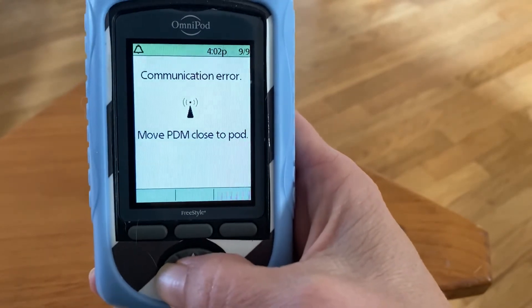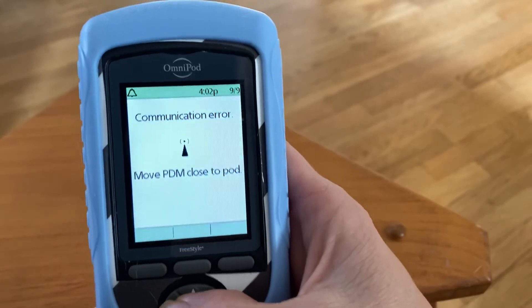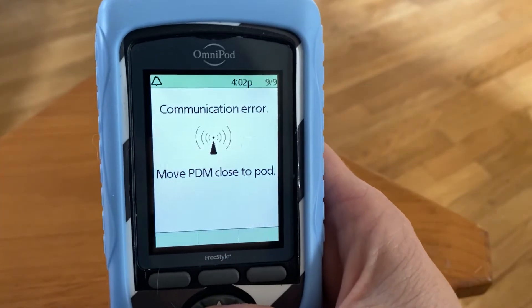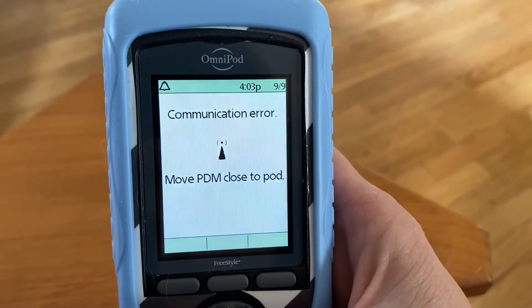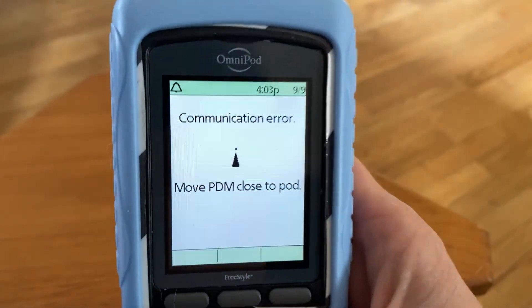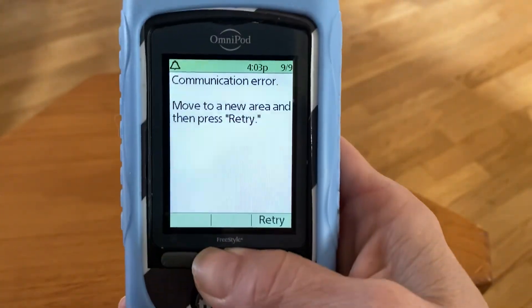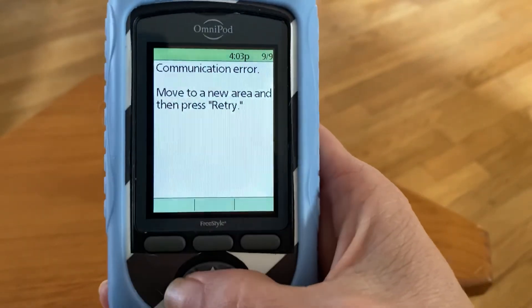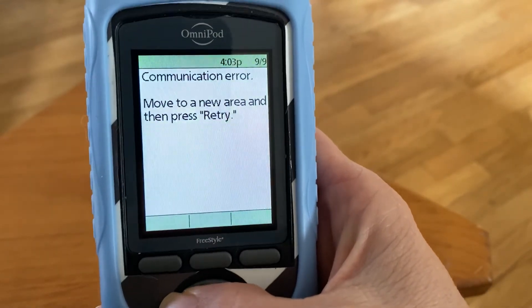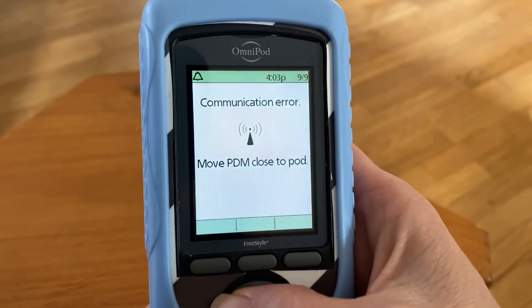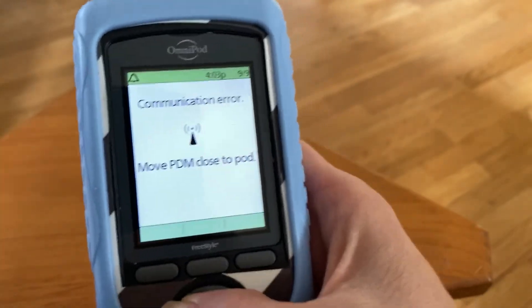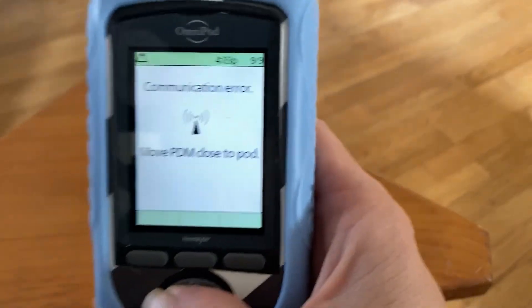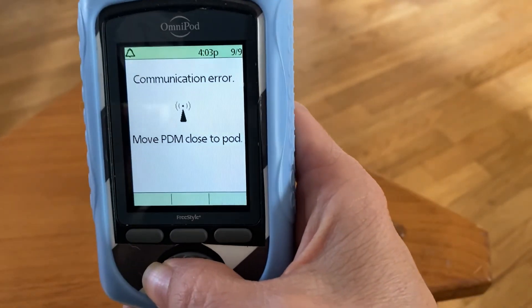The other option in there was to suspend the basal — I've never done that. That would only be in a really bad situation where she was extremely low and you wanted to shut off insulin delivery completely. You would go to that same place and select suspend insulin delivery altogether. That would be for a very extreme low. Anyway, I just thought I'd send that to you — thanks.